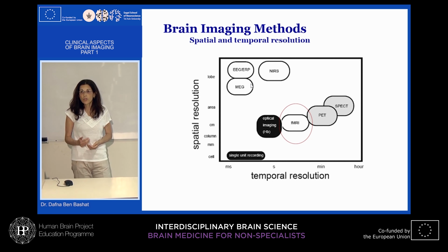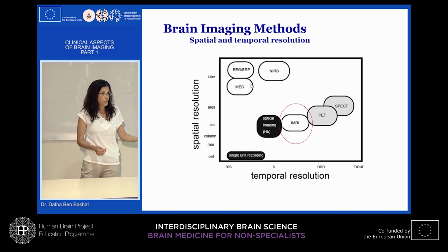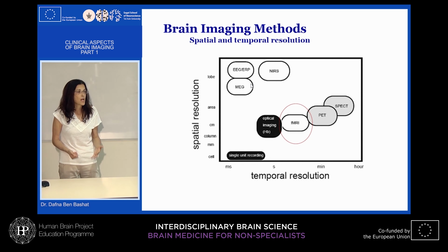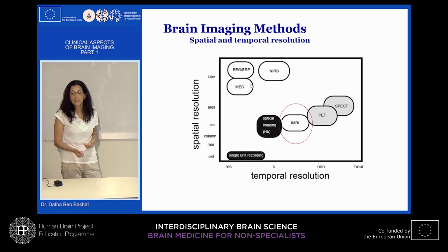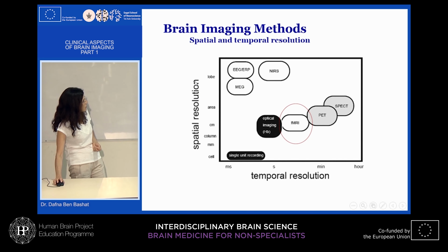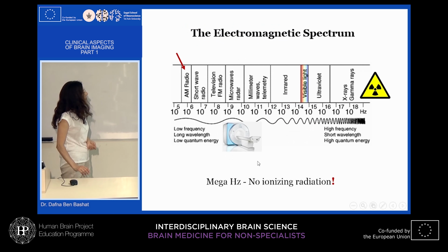For spatial resolution, the main motivation has led to a lot of new pulse sequences, a lot of new methods, and the shift towards high magnetic fields. We now have 7 Tesla, which is approved for human clinical studies, and they are developing 14 Tesla. So we're really pushing in those two directions, high spatial resolution and high temporal resolution.